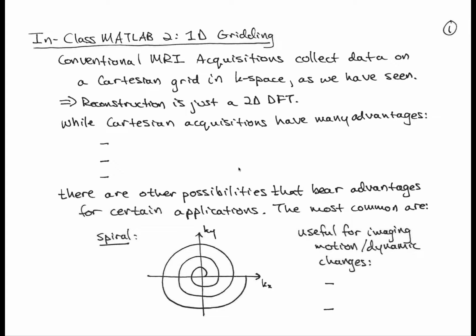Welcome to our MATLAB exercise on one-dimensional gridding. First let's talk about a little bit of motivation, and this will be a bit of a repeat from some of the stuff we talked about in class, but just to make sure we're on the same page, we'll go through it here again.